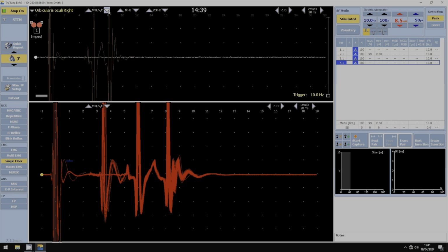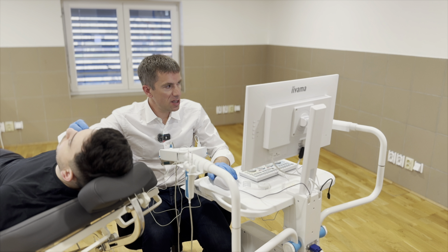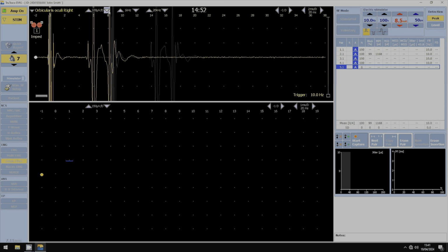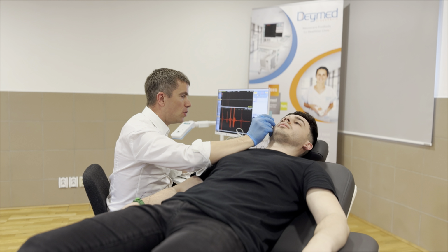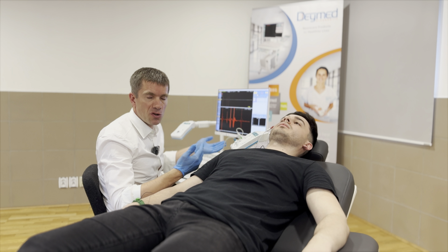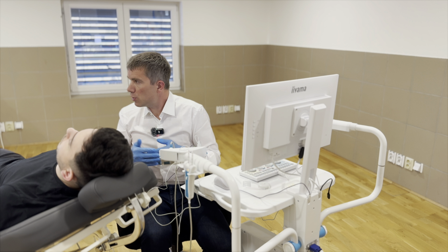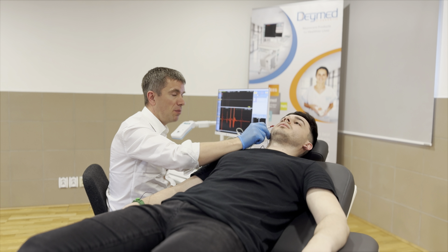I will go to the next insertion, start stimulation, and turn the needle a little bit so that I have other muscle fibers in my scope. I hear the sound is slightly different because it's fibers from another direction. And I start recording. So let us analyze some of our recordings. Meanwhile, we can leave the needle because we need more pairs, or we can ask the patient to relax a little bit and take the needle out. But of course, then we need to insert the needle again. This depends on the examiner and on the comfort of the patient.